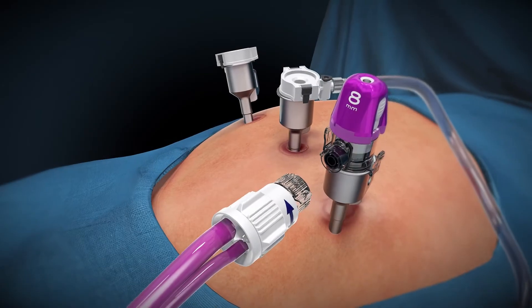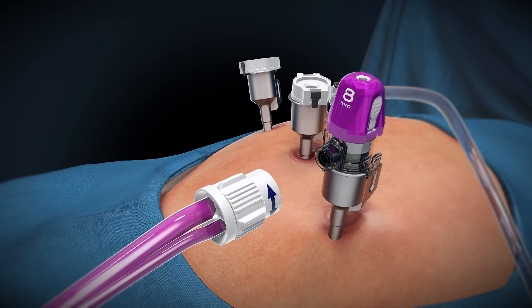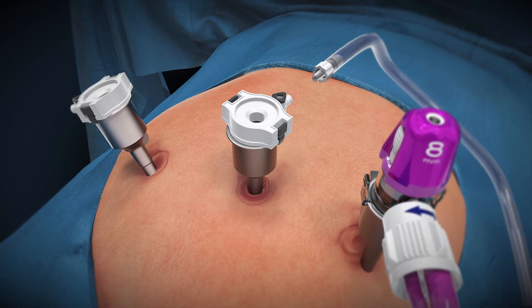After all ports have been placed, remove the manifold plug from the purple end of the bifurcated tube set and connect it securely to the AirSeal cannula cap. Move the clear lumen of the bifurcated tube set to a non-optical port.